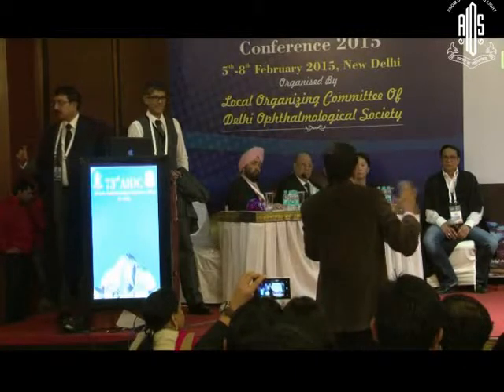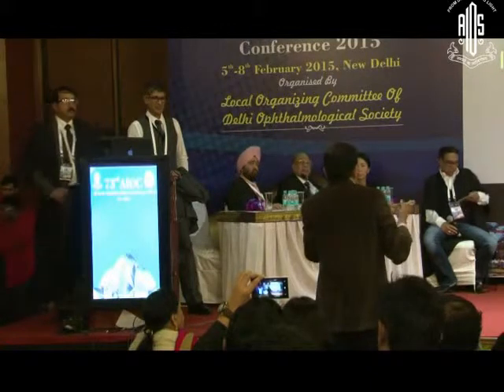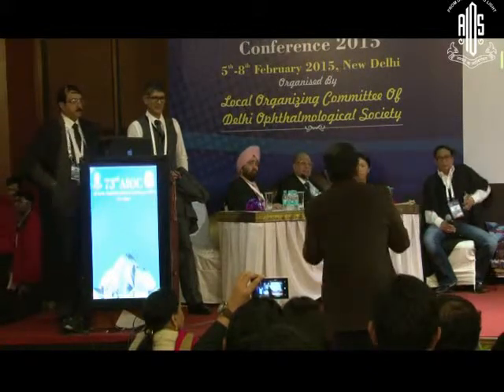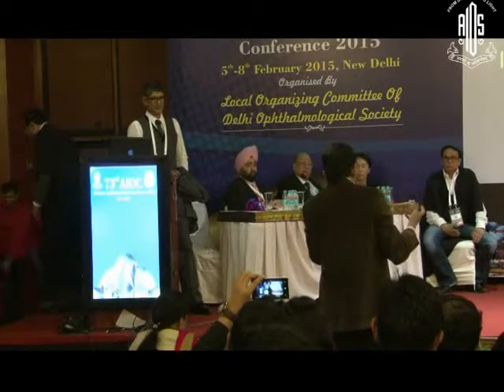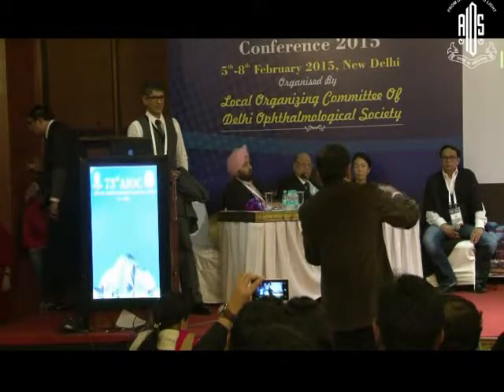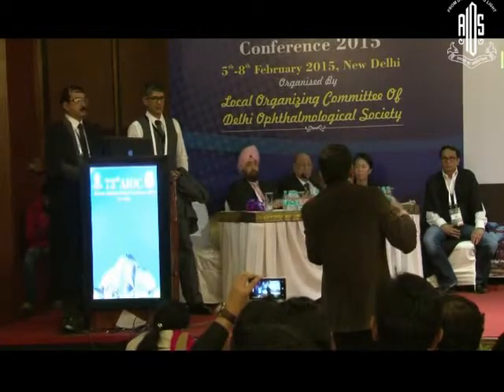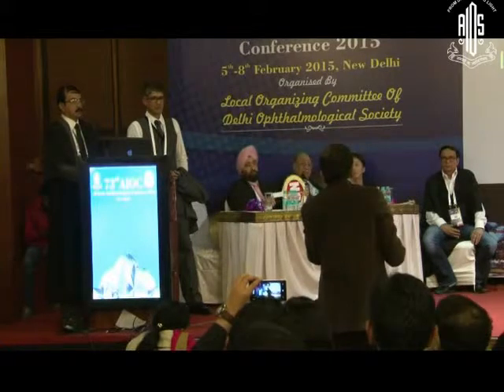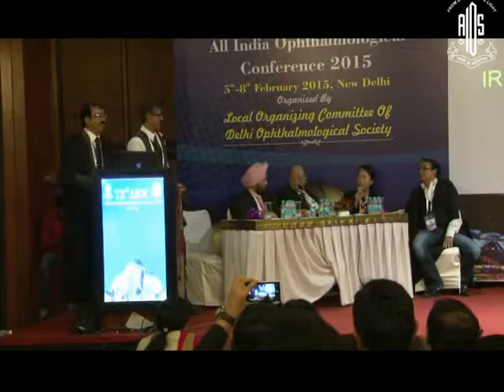I hear that there is a tendency for ICLs being used as a piggyback lens by other surgeons also. Maybe it's not a good idea. Maybe in this case, because of a lack of choice, he did that. But otherwise, using a regular piggyback lens may be a better idea because the spacing and configuration of the eye when the cataractous lens is replaced by an intraocular lens is very different. And ICL has not been substantiated to be placed as a piggyback lens. The sulcus doesn't change. I think he's done a great job, and because he's Superman, he can do all these acrobatics very well.